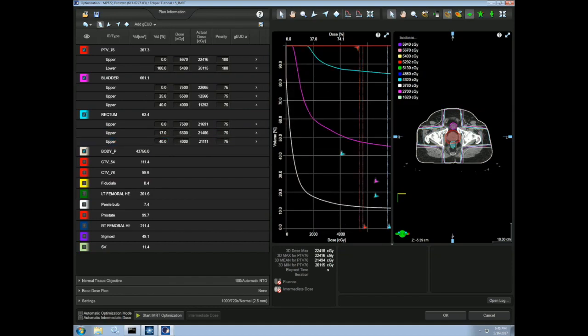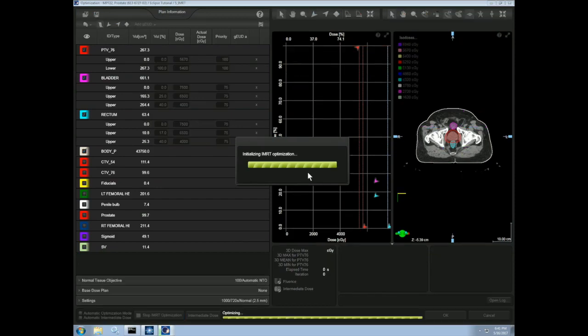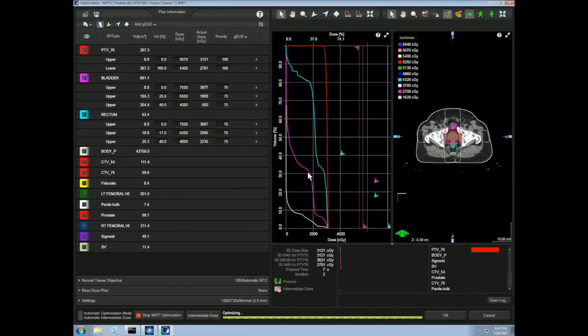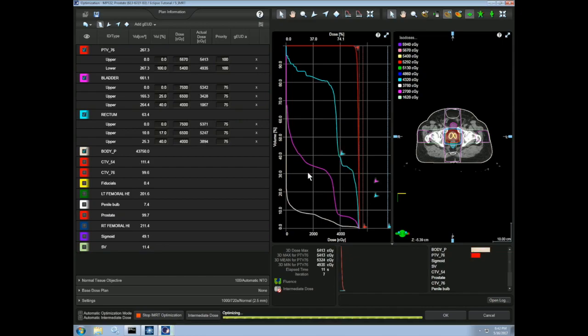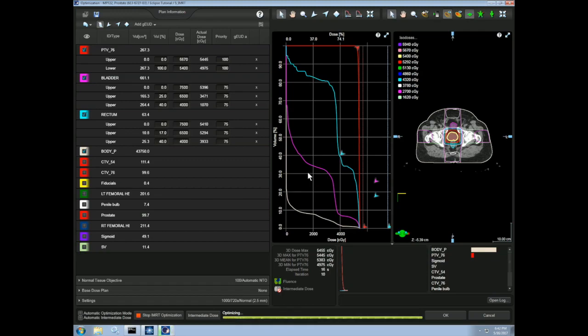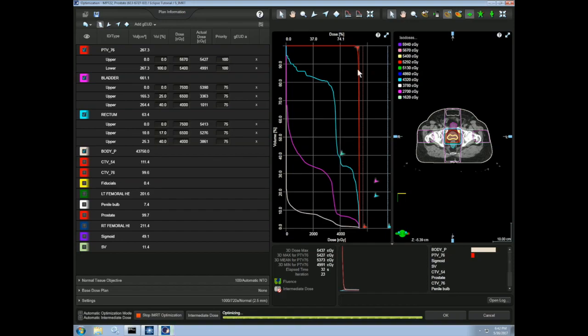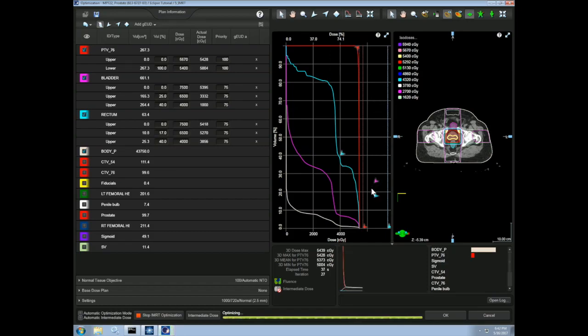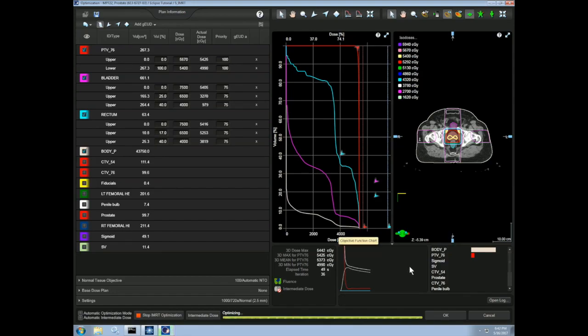Now that we have all of our constraints, let's click on Start IMRT Optimization and begin the optimization process. The optimization algorithm uses a cost function, which is essentially the summation over all structures of the product of a structure's priority with the difference between the desired criteria and the actual criteria. The algorithm is optimized once this cost function is minimized. This cost function can be seen in this window as the optimization proceeds. As we hover over the constraints on our DVH, we will see different sized circles. These circles correspond to the current cost of that structure. You can also see the current cost of the structure on the right in a histogram. Once the cost function levels out, the optimization has converged and we will have our optimal fluence map.